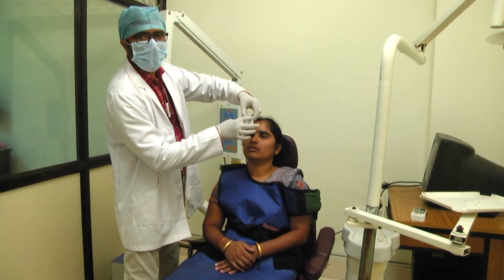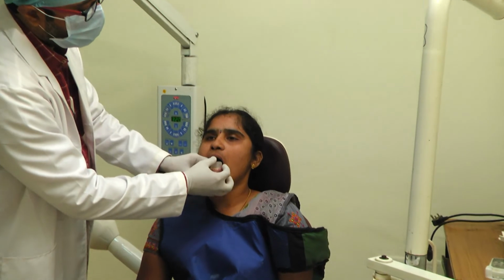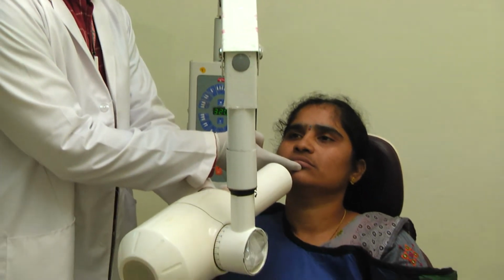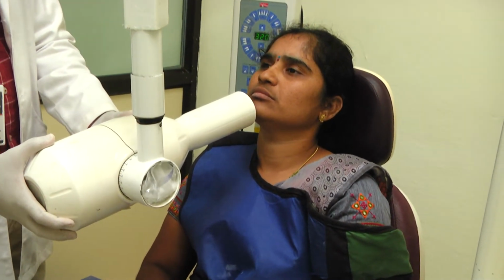and make sure the raised dot or knob is towards the occlusal or incisal surfaces. So this is how the placement of the film should be. Slightly tilt the head in order to compensate for the changed occlusal plane. Once it is done, the point of entry of the central X-ray beam is at an angulation of minus 15 degrees, just below the lower lip, directing towards the film. So this is the point of entry for the mandibular central and lateral incisors.